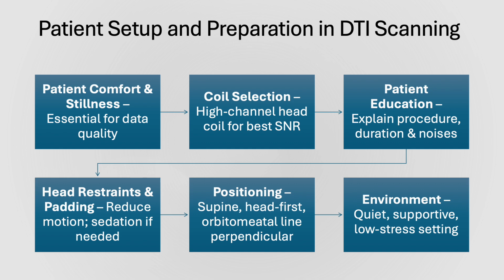So also use foam pads or inflatable cushions to minimize head motion. In pediatric or uncooperative patients, sedation may be necessary. So always coordinate these with the anesthetist in these cases.